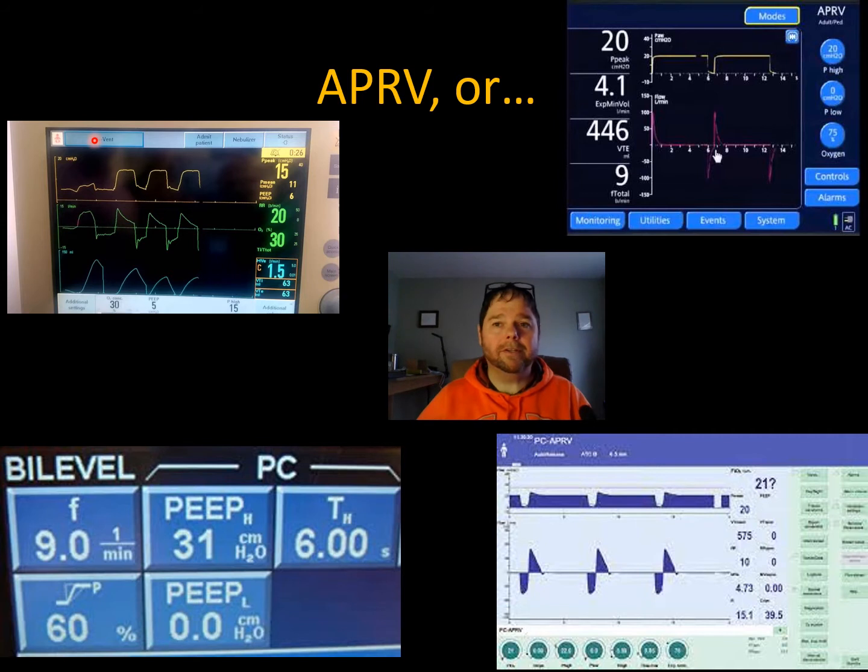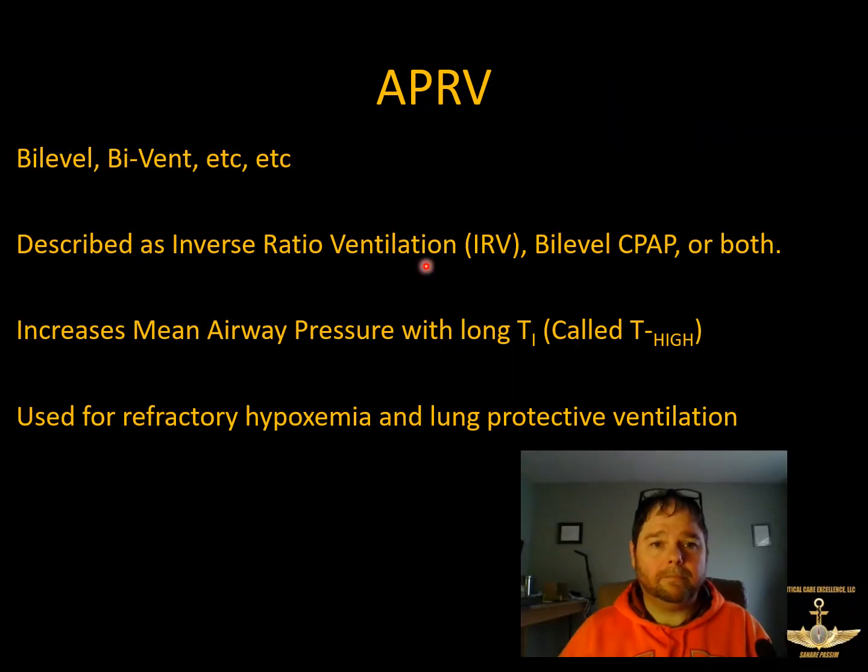There are some different mechanisms on the inside, and some more limitations on this particular ventilator, but when you see bivent, it means it's working just like APRV. And this is the front face of a Puritan Bennett ventilator, which you'll see in a handful of the facilities we go to, and it says bilevel. Bilevel, also APRV. So these all work exactly the same way, and the most important thing about that is that you won't find that on our ventilator.